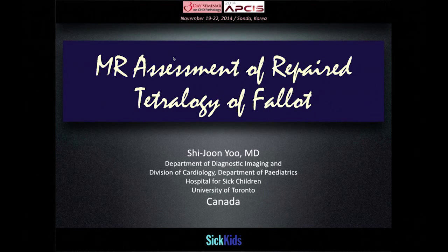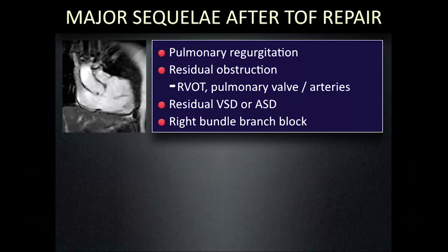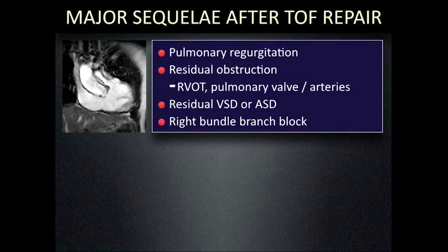Okay. The topic I was given is MRI assessment of repaired tetralogy of Fallot. The handout has a few more slides than I want to talk about, because 20 minutes is not enough to cover everything, so I reduced the slide number a little bit. We all know that after TOF repair, you have a lot of problems.